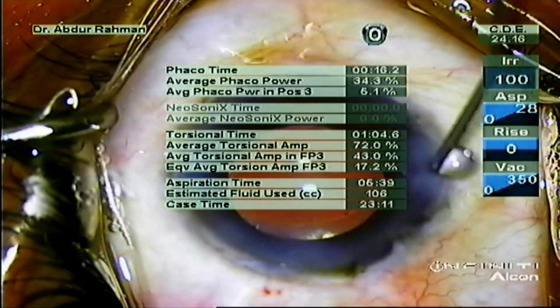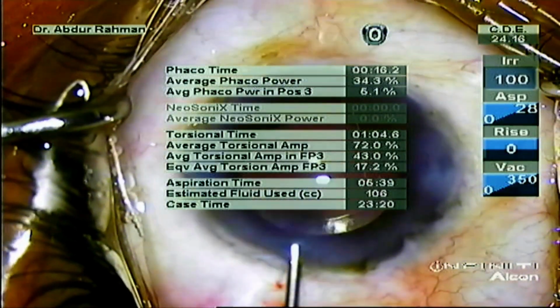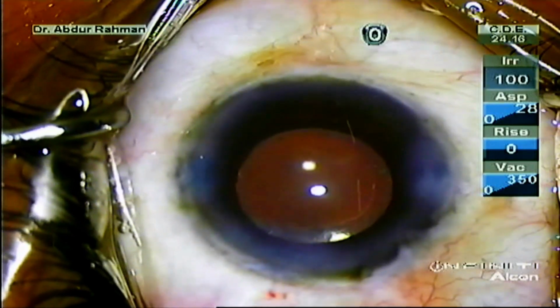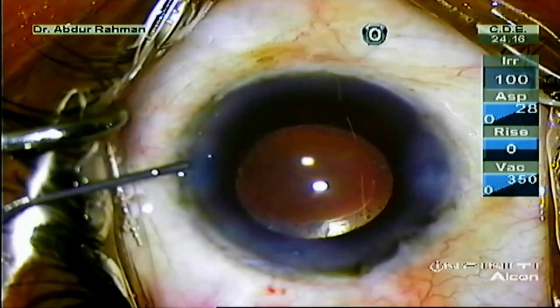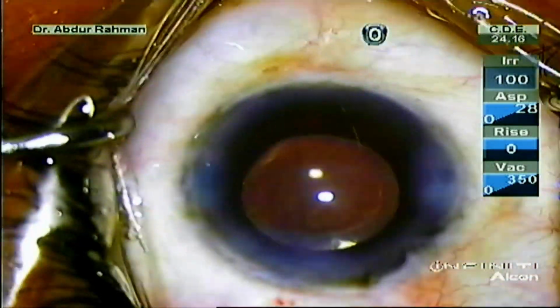Now I'm performing stromal hydration of the side port and main port. At the end of the surgery, I'll give intracameral antibiotic followed by subconjunctival dexamethasone injection, and the case is completed.